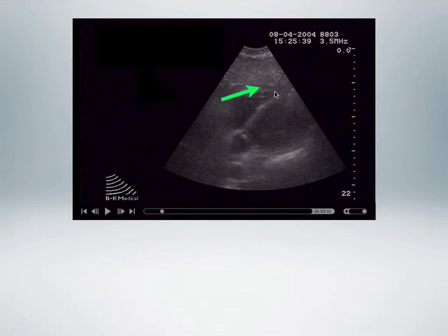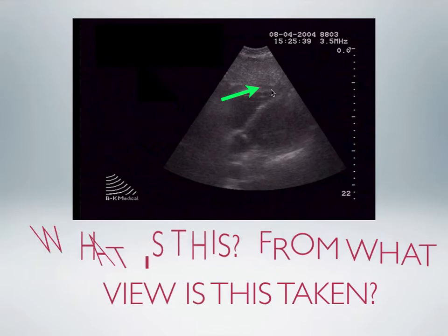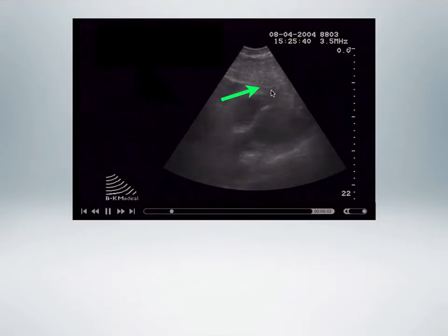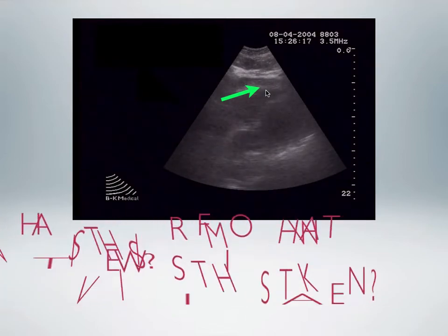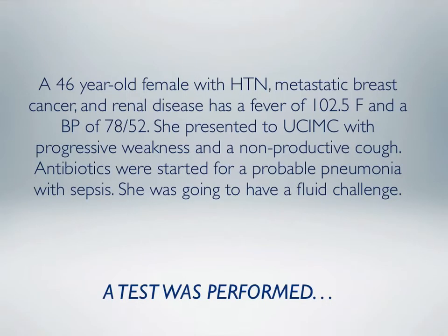And you'll see that in this pericardial space right here, there is something. It's not quite clear. And there's something attached to the heart. That's pericardial fat, a normal finding. And it sticks to the heart and moves with it. So that's just a normal pericardial fat pad.